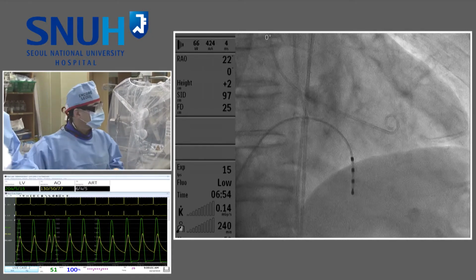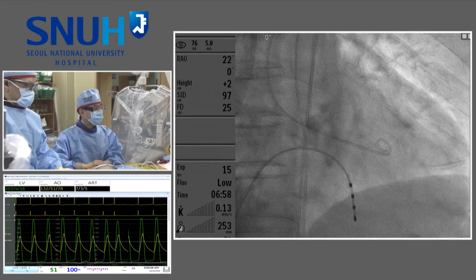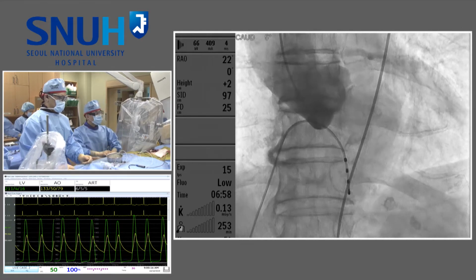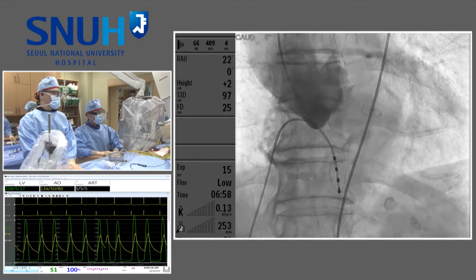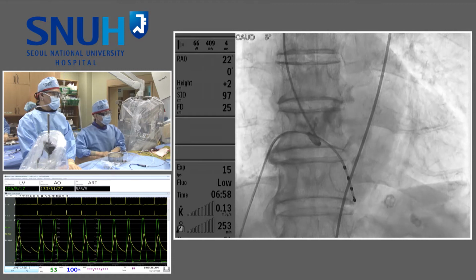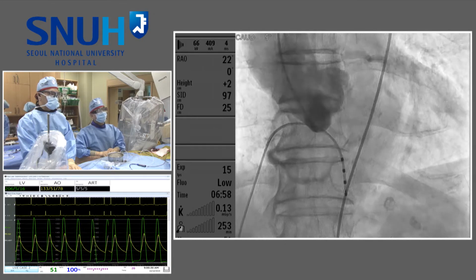Well, good morning. You are stunningly well prepared for this live case, giving us a lot of headaches here. I think this is a very interesting case under all the aspects that you summarized. And be it a SAPIEN or an Evolut, can you tell me again, because I might have overlooked it, what the perimeter is? Was it 85?